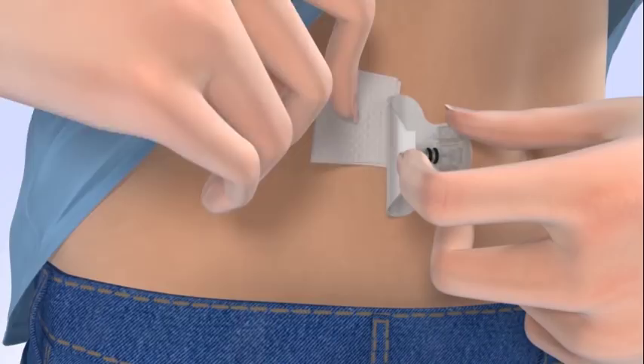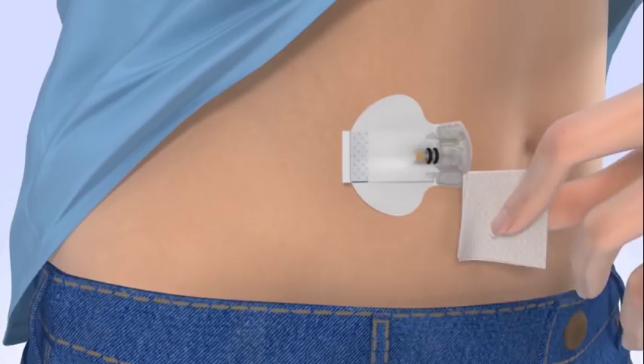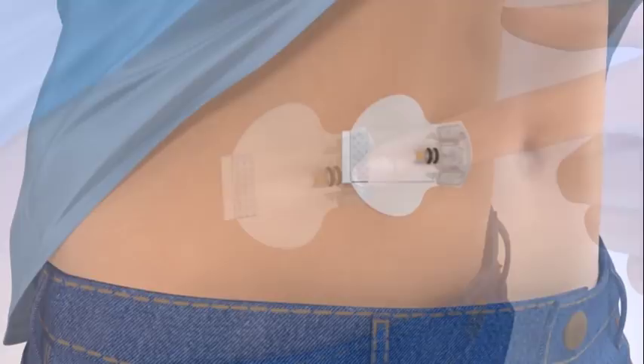With the other hand, wipe the skin beneath the adhesive. Be careful not to pull the sensor out. Next, wipe the area around the sensor, including the adhesive pad, and wait for the liquid to become dry and sticky.